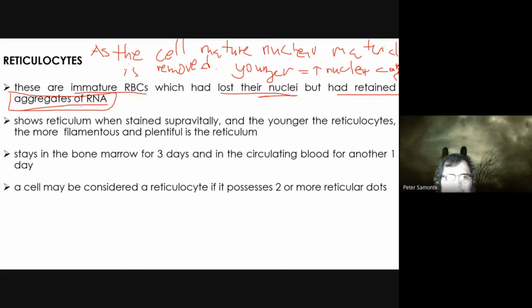Now, these aggregates of RNA are called your reticulum, and are stained supravitally. What is a supravital stain, class? If you recall our previous lessons sa lab, what does your supravital stain do? Staining of live cells.